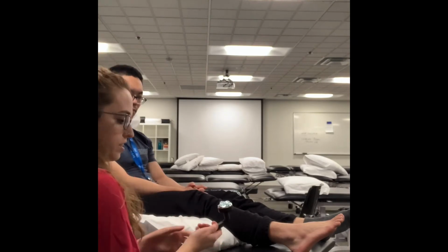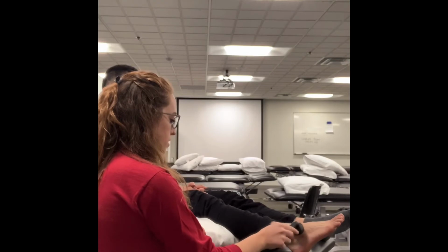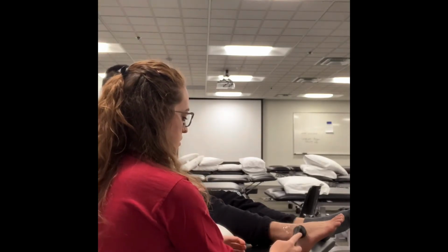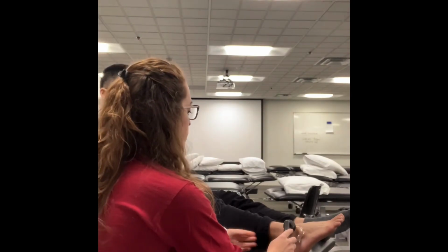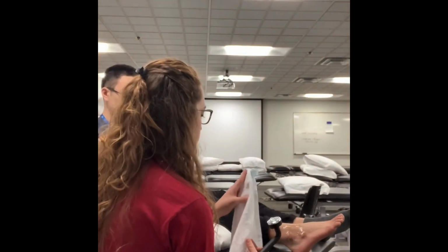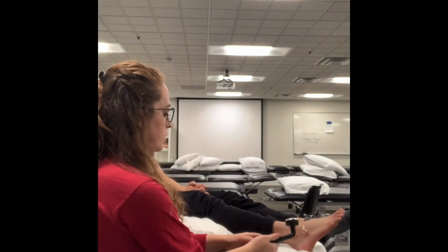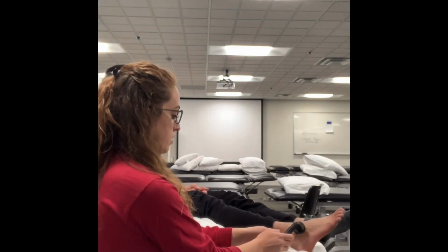Okay. So it's going to be really cold. I'm going to get this going and get it spread out a little bit, and then I'll start the machine. So you should not feel any discomfort or anything. Actually, I'm going to grab a towel before I start. Okay. Can you lift your foot up for me? There we go. So there shouldn't be any pain. If there is, please let me know and I'll shut the machine off, okay? Okay.